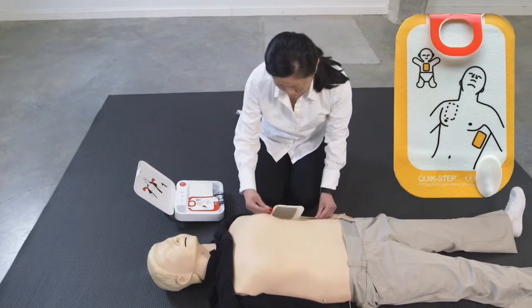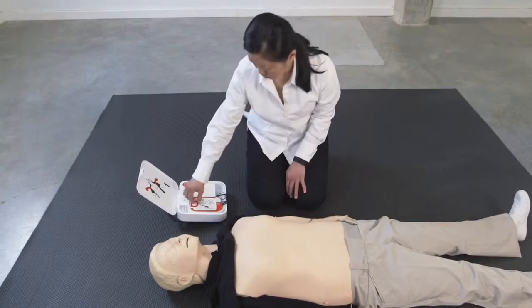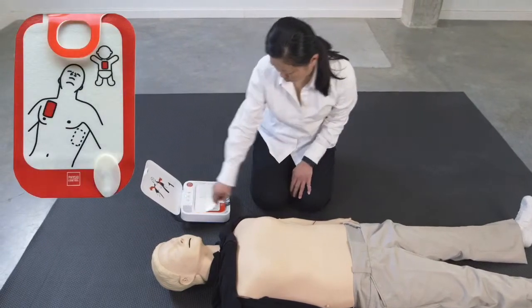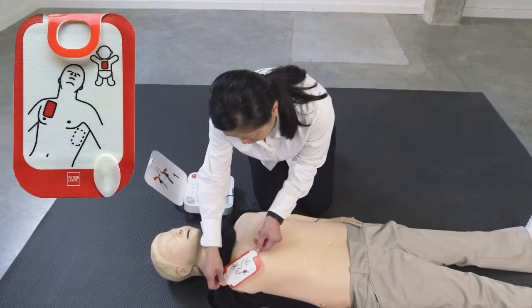Press pads firmly. It is recommended to continue compressions while the pads are being applied to your patient. Apply pads to bare skin exactly as shown in the pictures.